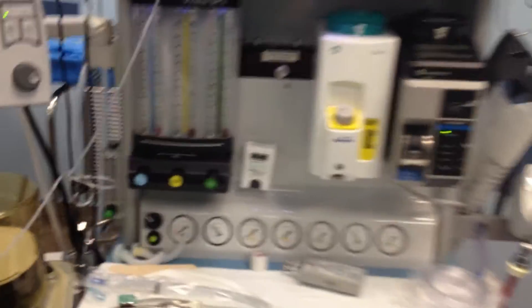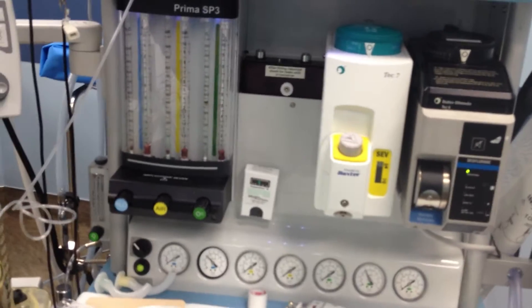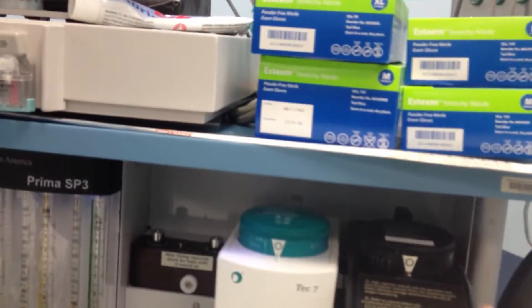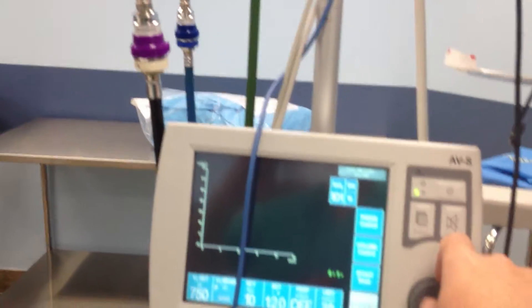It's got quite a few analog gauges. Of course, it's got your two gases, and it's got your controls here.